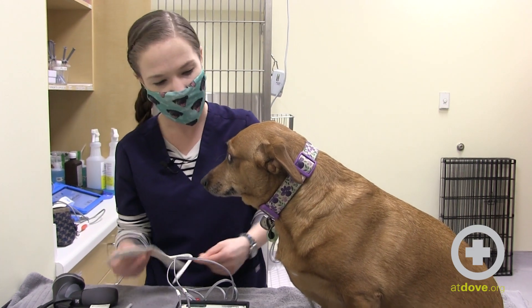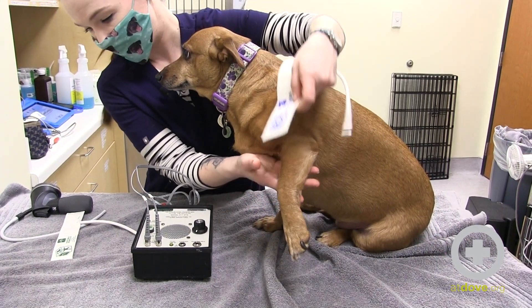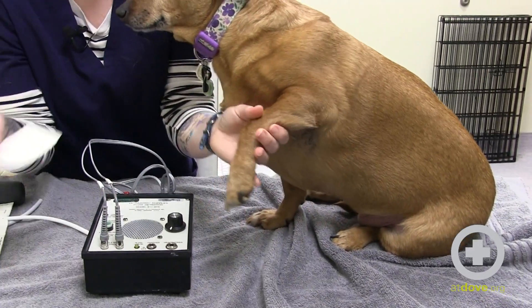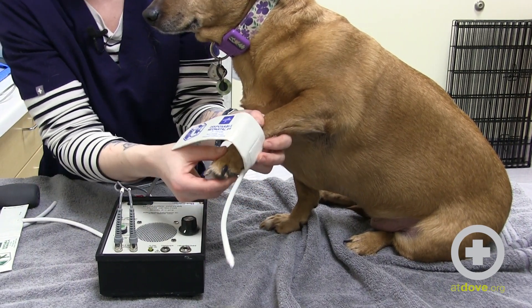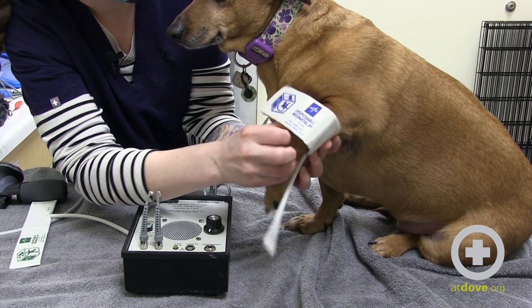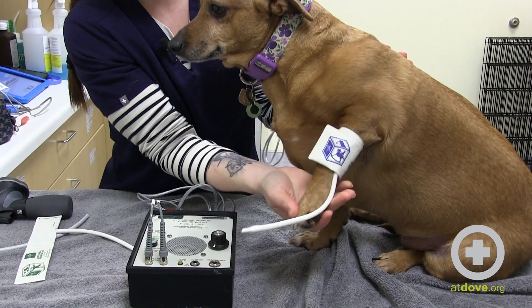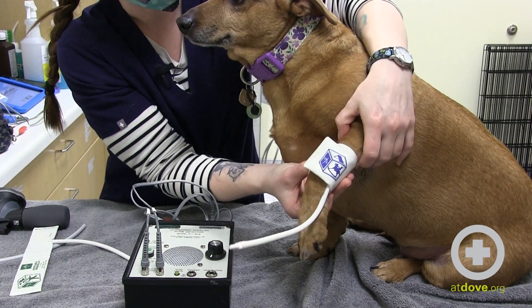So we're going to fit Penny with a cuff. For dogs, the cuff size should be about 40% of the circumference of her leg. I know she's going to be between a 3 and a 4 — I think a 4 is probably going to be more appropriate. Positioning is also something that can occlude your vessel. If I go too low, I'm going to cover up the space where I need to go, or not give myself enough room to place the crystal to find it. So we're going to go up above where we need to place our crystal. When you place the cuff, you don't want it so loose that it's going to slide right off, but you don't want it so tight that it's occluding the vessel. It should just be nice and snug.